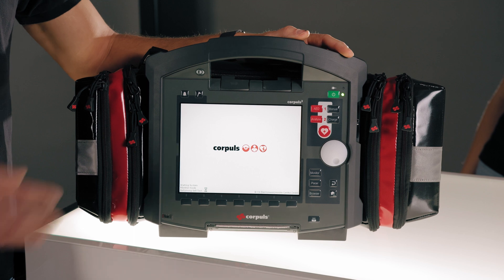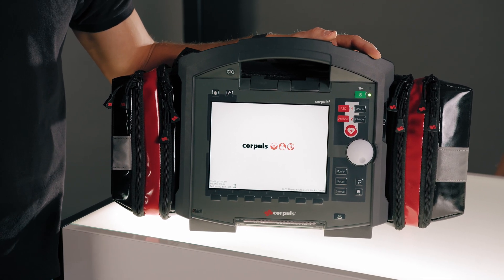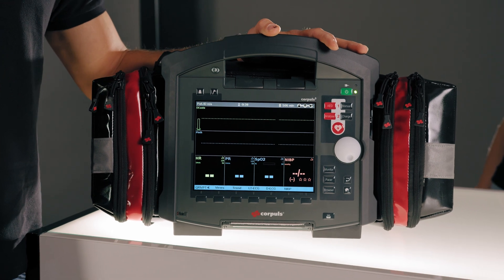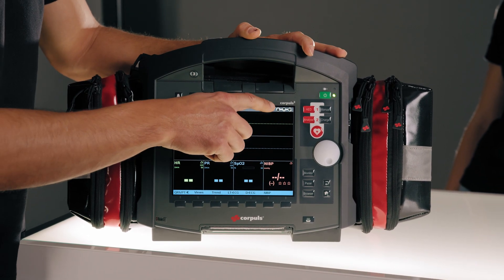What we see here is that the home screen appears and the device runs a self-test. The jog dial lights up briefly. Now we see the start screen showing the battery capacity, and that all three modules are connected here in the top right of the status display.